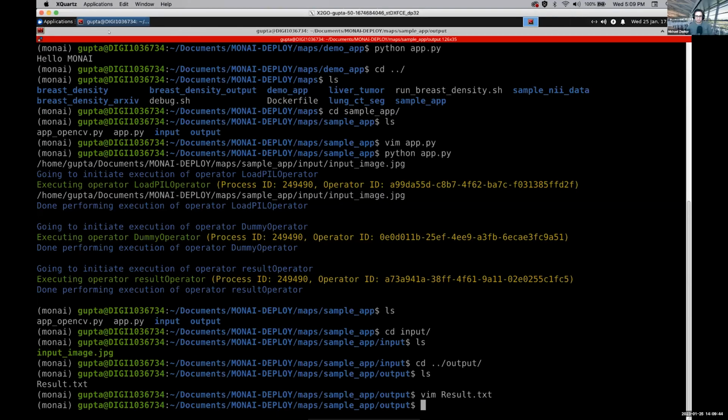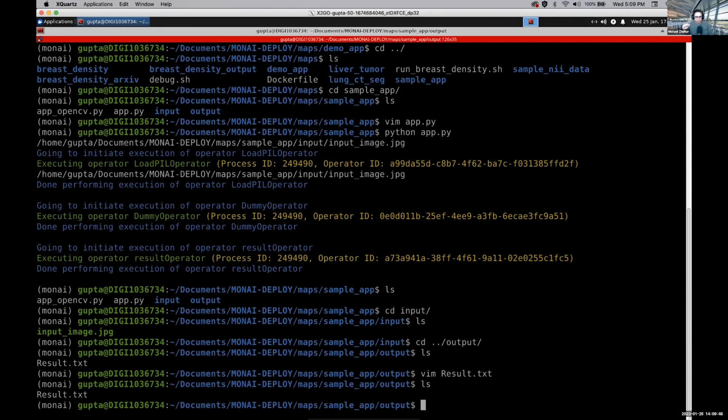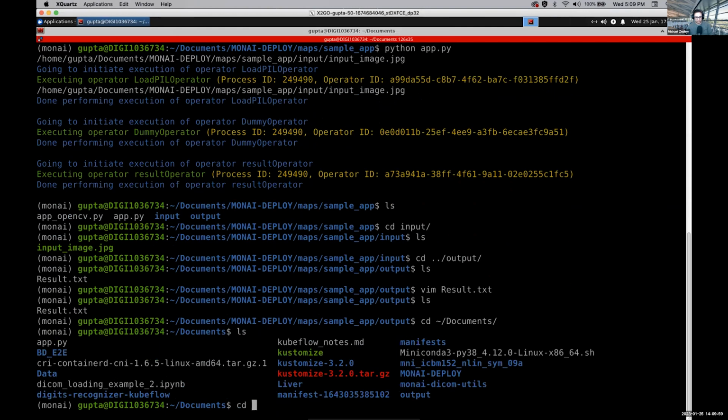Yeah, there was one that came in, and it might be answered as you go through this. The question is, do maps always have to run completely on the same node, or can they also be distributed across multiple nodes in a cluster? For us, it would be super useful if some operators could define specific resource constraints, like higher RAM, GPU, etc.